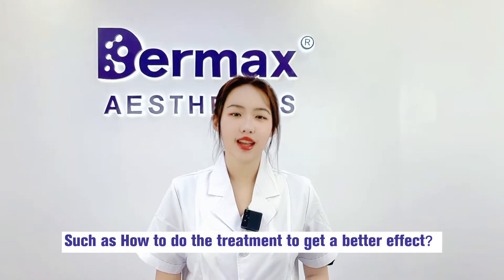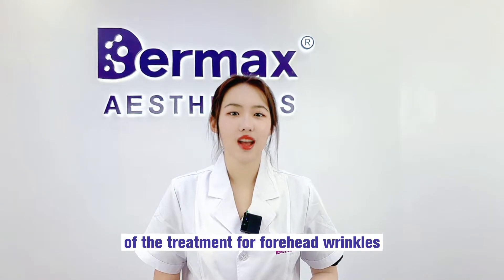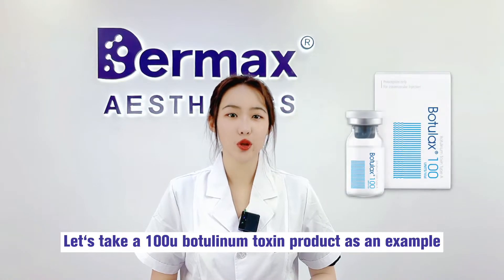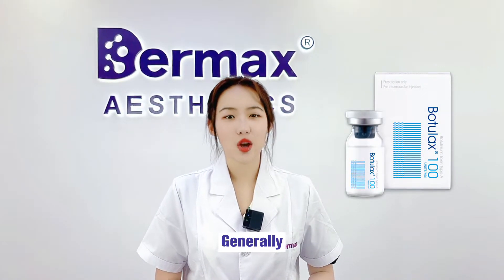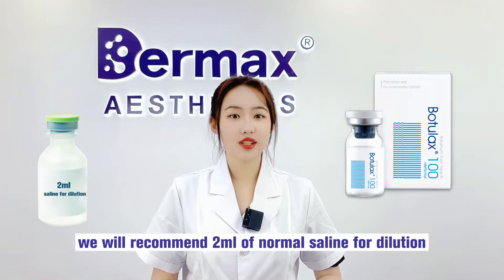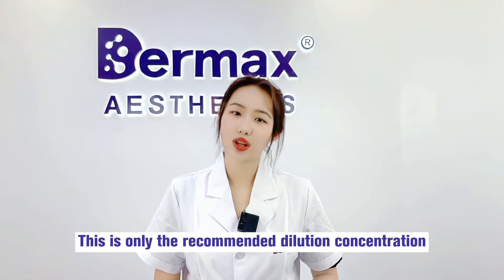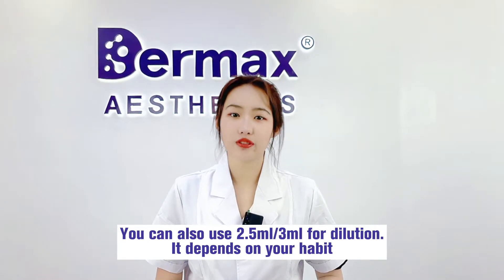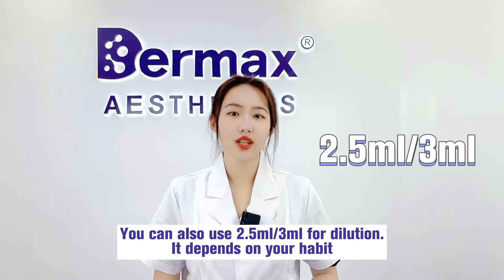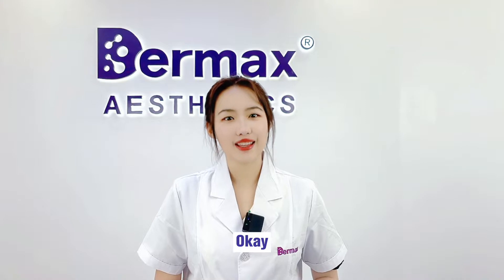Today we will give a detailed description of the treatment for forehead wrinkles. Let's take 100 units of botulinum toxin product as an example. Generally, we recommend 2 ml of normal saline for dilution — this is only the recommended dilution concentration. You can also use 2.5 ml or 3 ml for dilution; it depends on your habit.